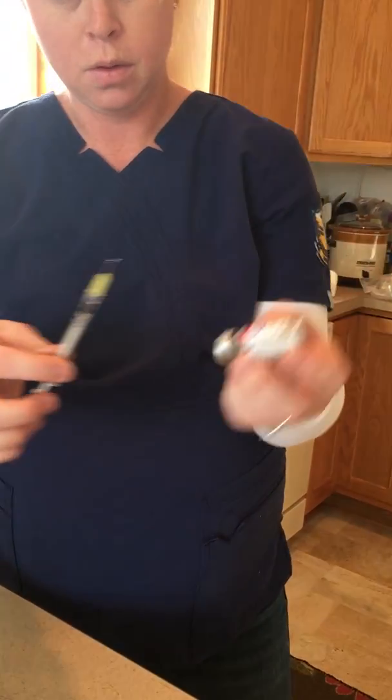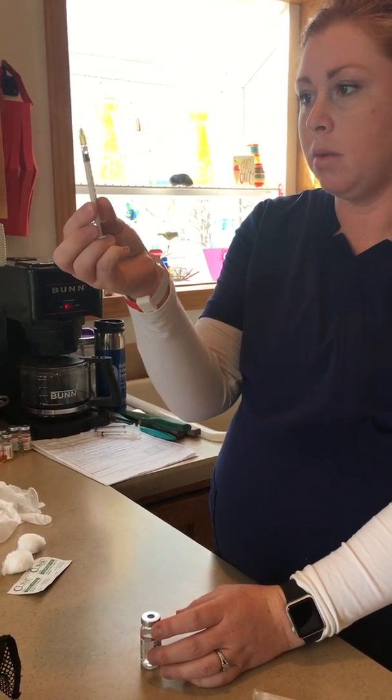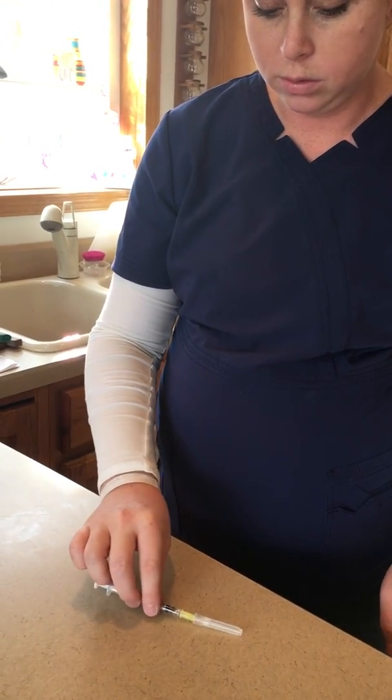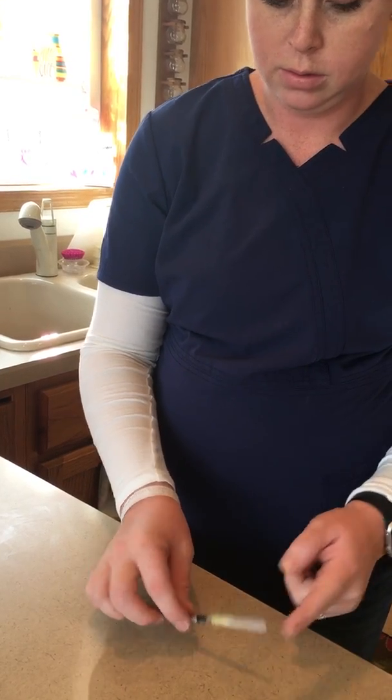Okay, I'm going to make sure that I have the right amount in there, and I do. I'm going to recap my needle very carefully using one hand, hopefully. Okay.